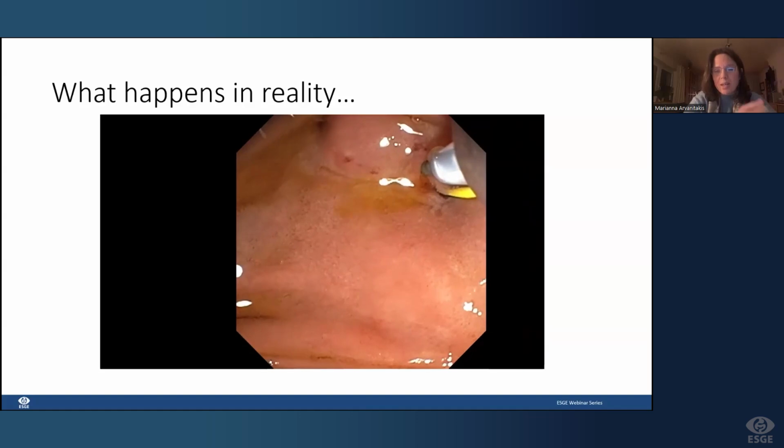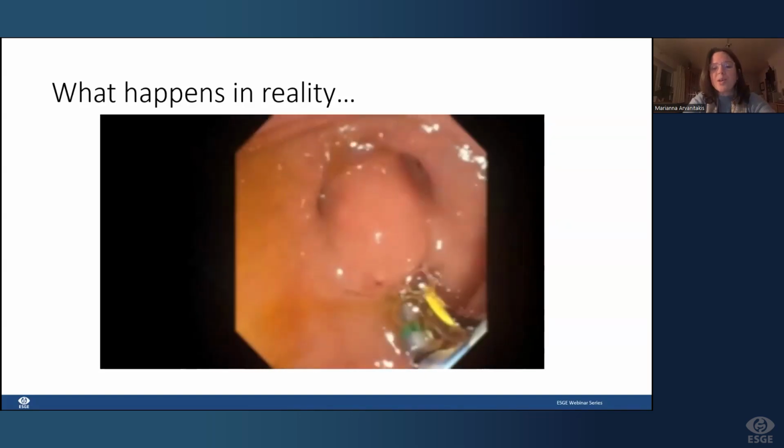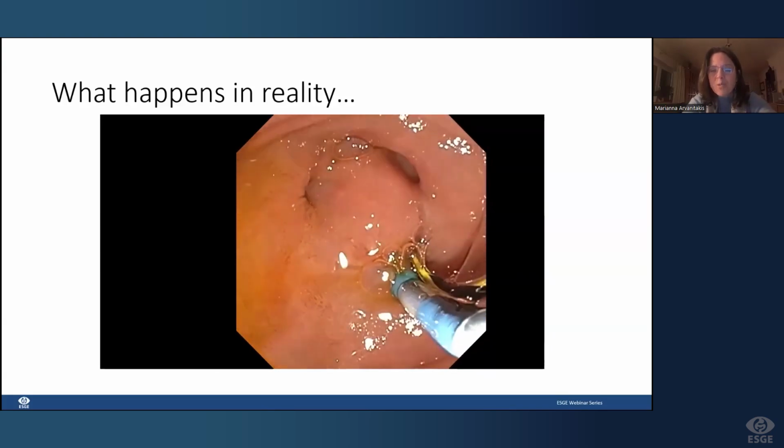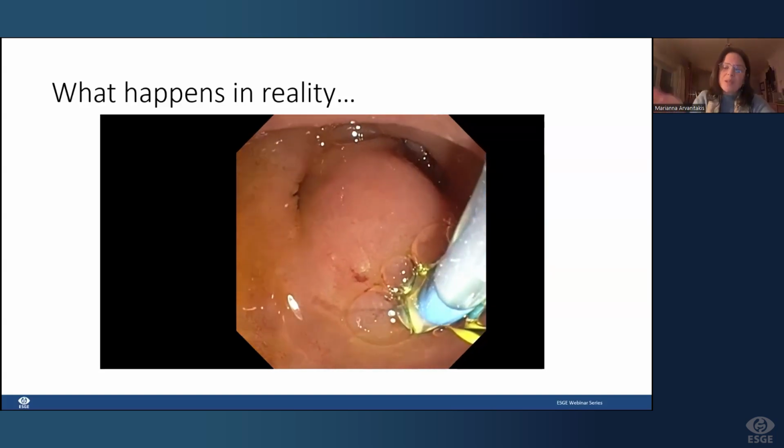So we will take out our sphincterotome, leave the guide wire there. And then we see that there's some bile coming out. We can imagine there's just on top of the guide wire that's already in the pancreas. The guide wire will help us straighten a bit the anatomy.